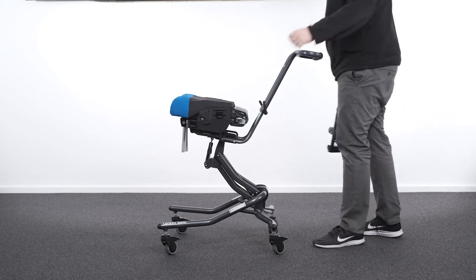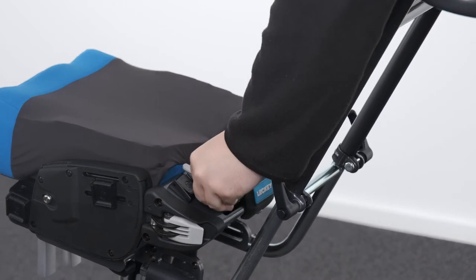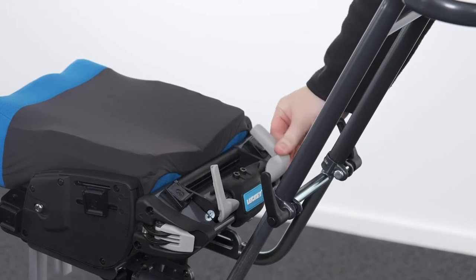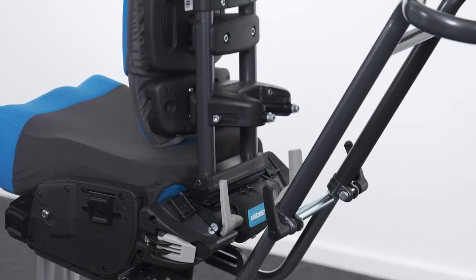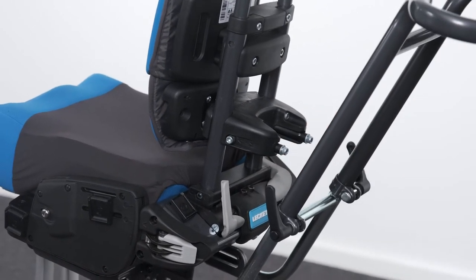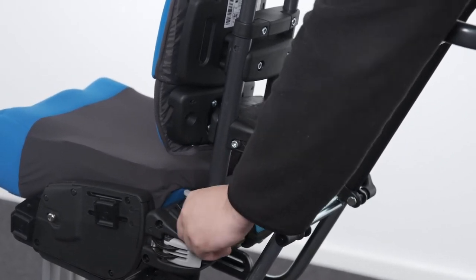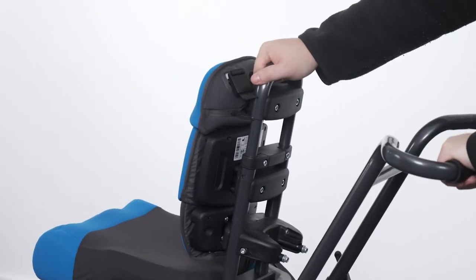Attaching the backrest. To attach the backrest, locate the backrest receiver at the back of the seat base. Open up the receiver lock paddles at the back of the seat base by pulling horizontally outwards on the paddles and then rotating upwards. Place the base of the backrest into the receiver ensuring it is as deep into the receiver as it can go. Rotate the paddles downwards and push inwards to secure the backrest in place. Check that it is secure by pulling up on the backrest and moving it forward and back.